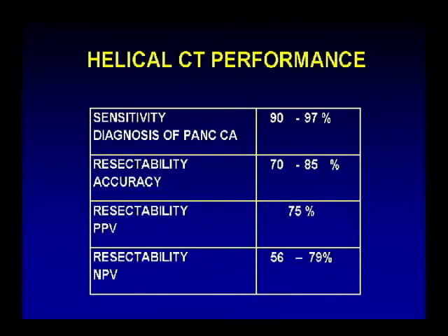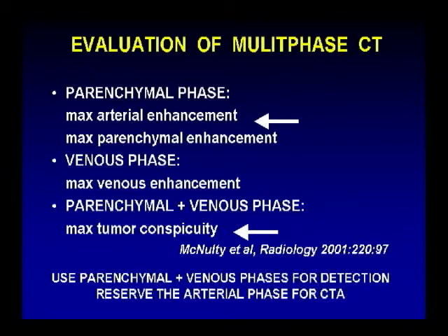And you can see that although multi-detector CT has high sensitivity for detecting pancreatic carcinoma, it does not do as well for determining resectability. Particularly in the negative predictive value category, you can see that it ranges from about 55% up to 80%.